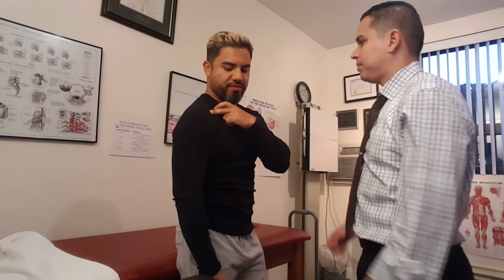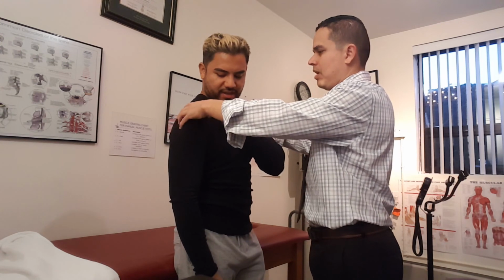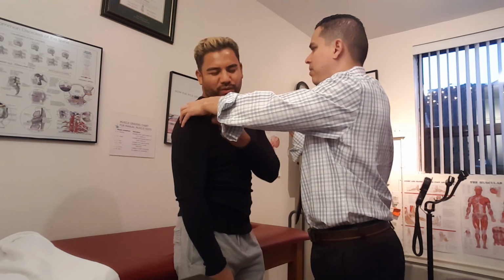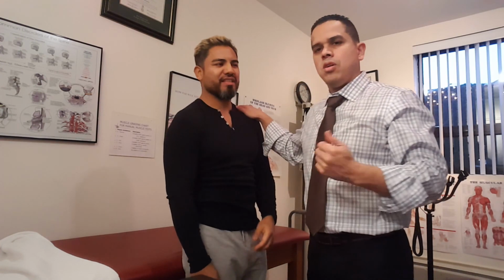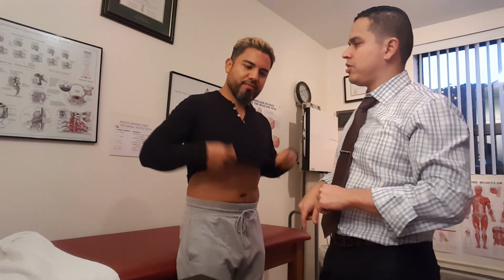Now, if you could touch me right here and go like that. No, right where my finger is. Right, but then go like that, like in the groove. Oh yeah, right there. That's the one I feel when I come across. Oh, yeah, right there. All right. So for those of you following, he's pointing right to the injury. All right, go ahead.